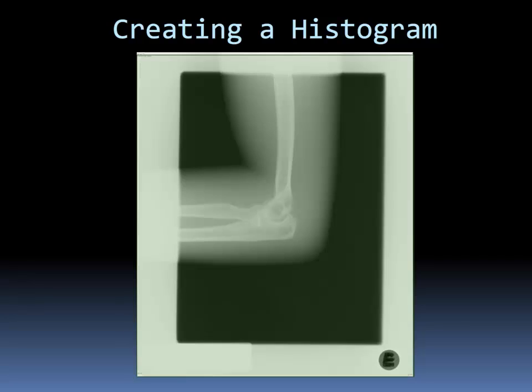In CR, the entire plate is scanned, and from this information the histogram is derived. In direct digital radiography, only the area of exposure is included in the histogram. Because of this, the histogram for CR and DR of the same part and collimation may appear slightly different. Histogram errors are more likely with computed radiography because of errors that can happen with detecting the collimated borders.